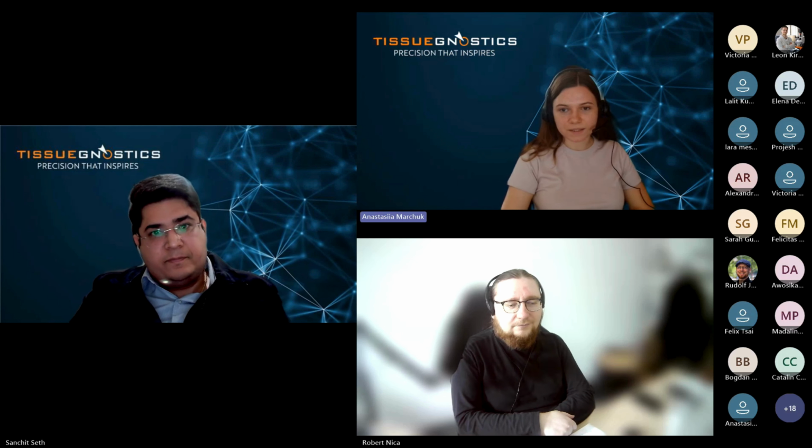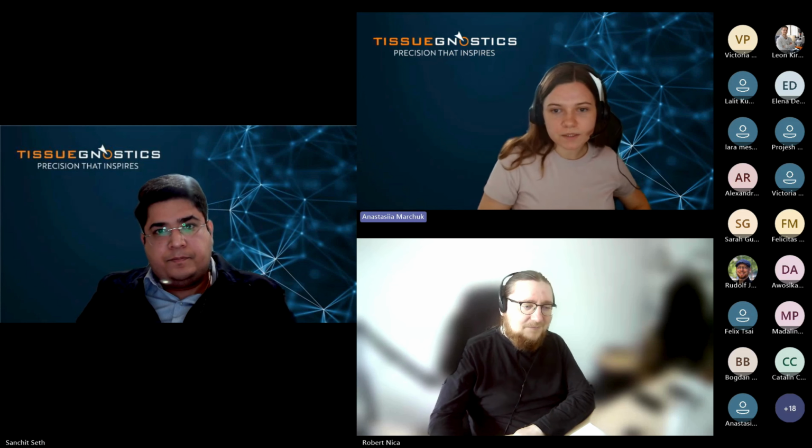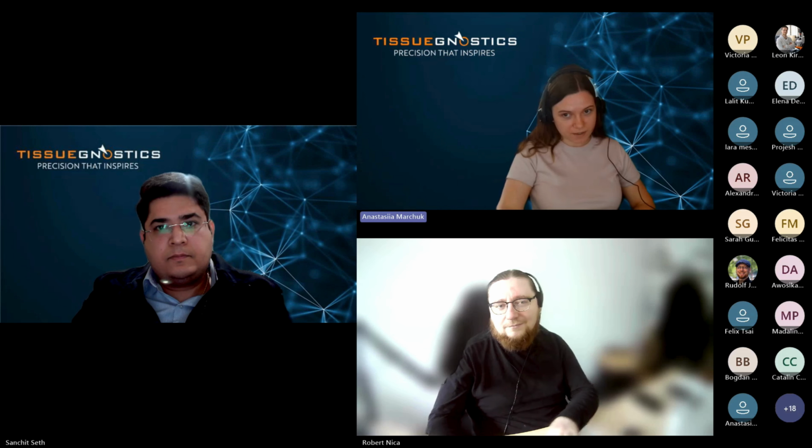I see. Thank you, Sanchit. Okay, let's move to the next question. I have custom analysis pipelines.